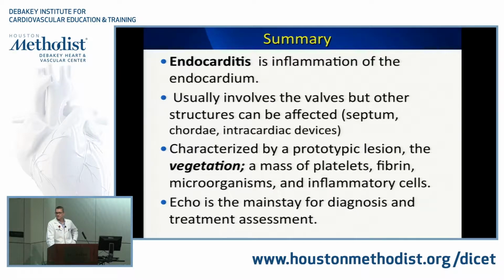I think my title was role of CT and MRI. There's basically no role for MRI. CT is good for finding funky things outside the valves, like tracks, connections to things, and whenever there's prosthetic material involved, then CT is really very valuable for surgical planning.